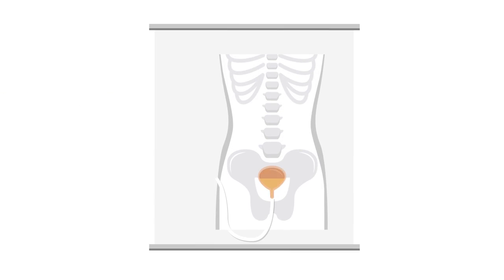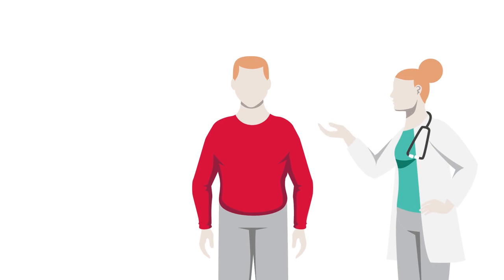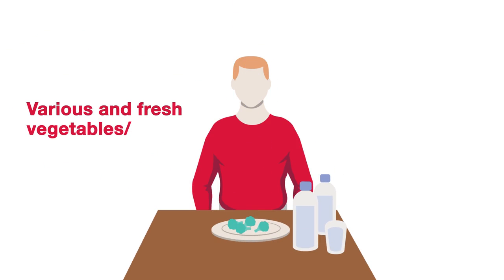Whilst research identifies that performing intermittent catheterization is the best treatment for managing urinary retention, certain preventative steps have to be adhered to maintain general health and reduce the risk of experiencing urinary tract infections. The following recommendation in performing intermittent catheterization will be advised by your healthcare professional, who will inform and train you on how to perform intermittent catheterization correctly. Always maintain good hygiene practices, especially in the genital area. Drink plenty of fluids and have a healthy diet.